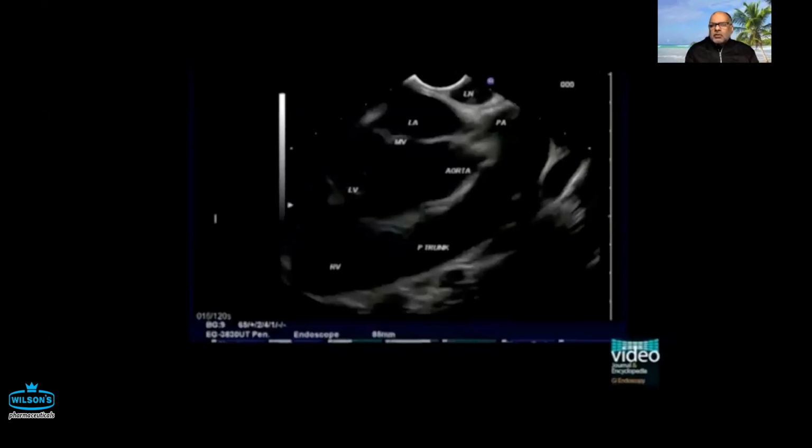In 20% of the cases, you still have to do a biopsy. That's why we sample all of them, especially if the lymph node is rounded, hypoechoic, abnormal, so discrete, right? But if you have an elliptical lymph node with a hyperechoic medulla and the shortest diameter is less than 1 centimeter, we're not worried.